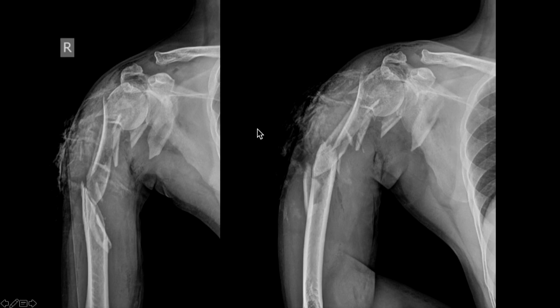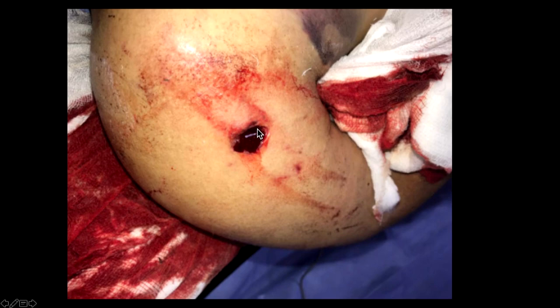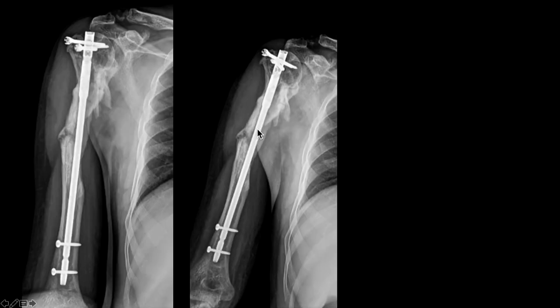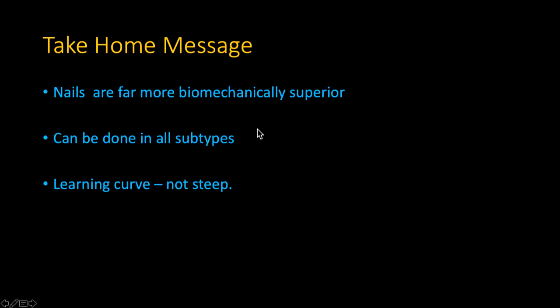The last case I'll be showing you is significantly comminuted fractures. What do we do in them? Again, we all know as long as the biology is preserved, union should not be a challenge. So get the neck shaft angle well, tuberosities well. This was an open fracture, nail them. Healing should happen, luckily, thankfully, whatever you want to call that. Since the biology is preserved, union should be there, and that's the range of movement.